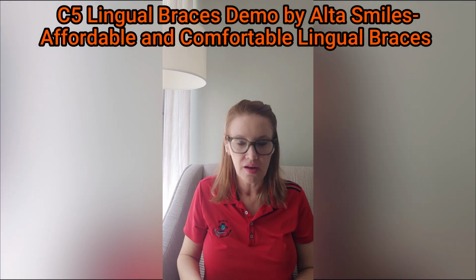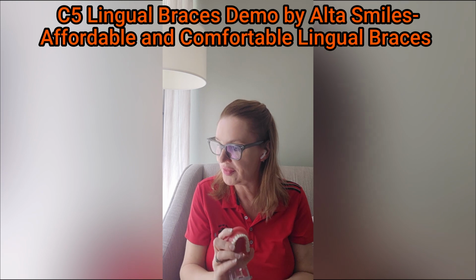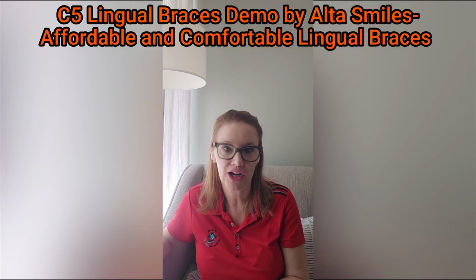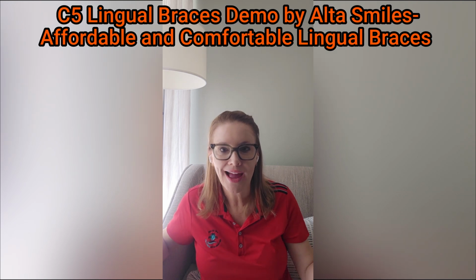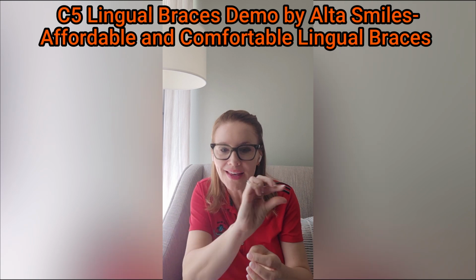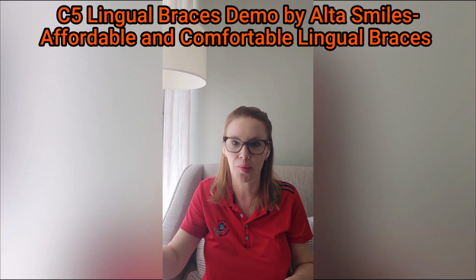Because you've got to have slide. But you can't do that. But what if you could, just with this wire? Well, what they do is they have a special wire that has a couple layers, and one layer, once you glue it, disappears. So now it slides. So it's like a layer that dissolves. And then there is a tube basically where the wire can slide inside the composite that you created.